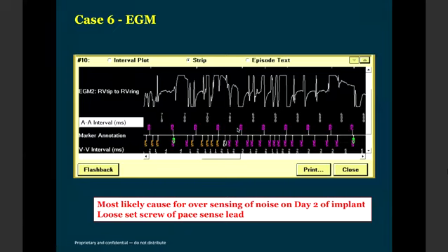When to use a single chamber device versus a dual chamber device? Yes. When there is a bradycardia indication, let's say a patient has got sinus bradycardia, you expect the patient to also need a pacing backup along with an indication for an ICD. I will prefer a dual chamber ICD because you can have the luxury of having AV synchrony by having atrial based ventricular pacing. So if there is a Brady indication, I will definitely opt for a dual chamber ICD, number one.